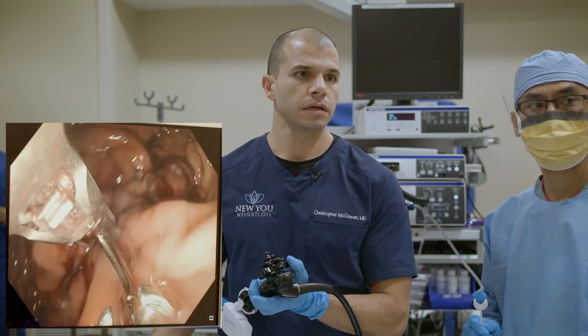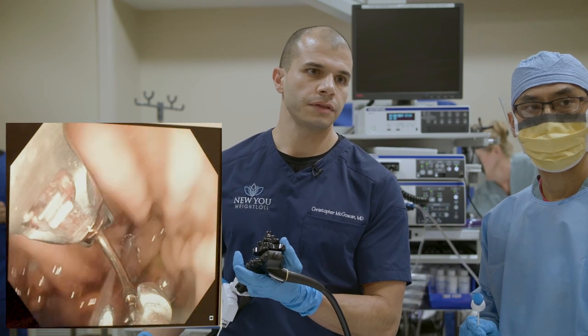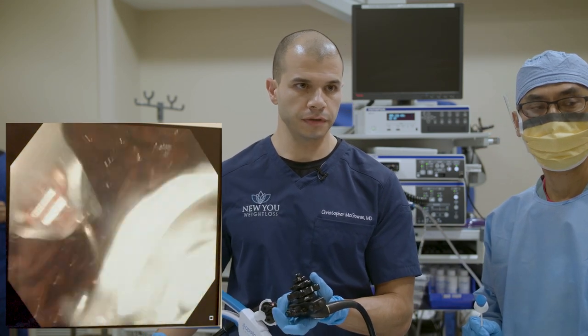We've done two circuits, working our way up, and the stomach is coming together. After the next suture, it's going to look much more obvious what we've done.